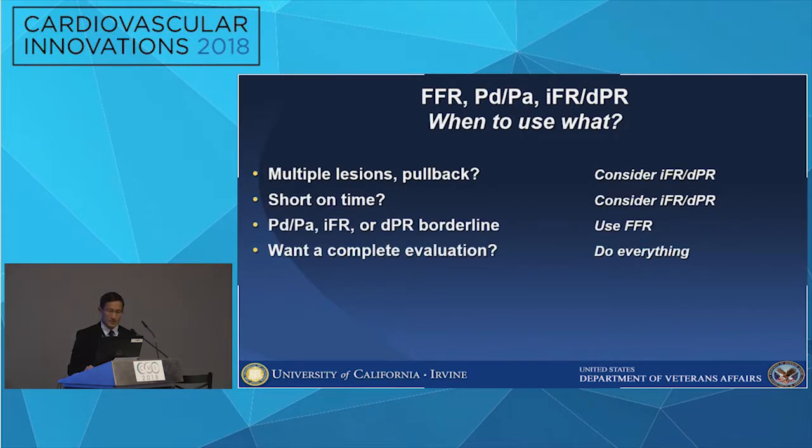So when you have multiple lesions or a need for a pullback, consider iFR or DPR. If you're short on time, actually, like we all are, consider iFR or DPR. If any of these are borderline, use FFR. Or if you want a complete evaluation, I do everything. And whichever one you choose, which one do you do? Which one do you listen to when you have discordances?